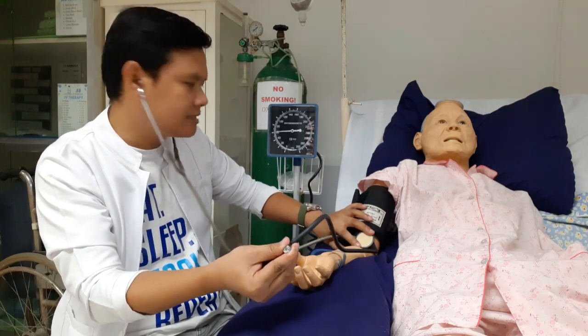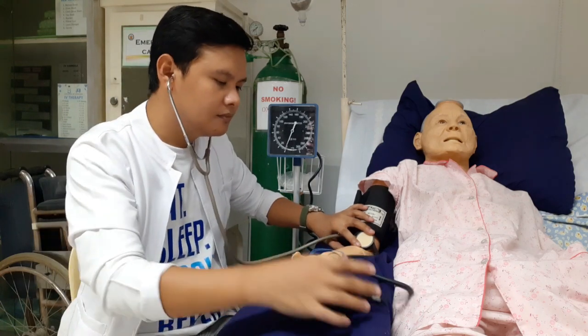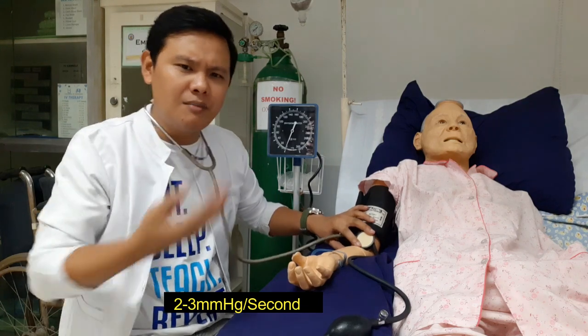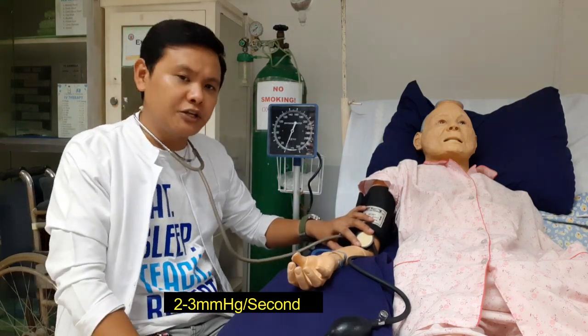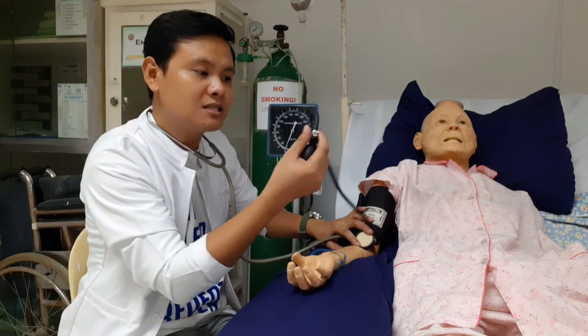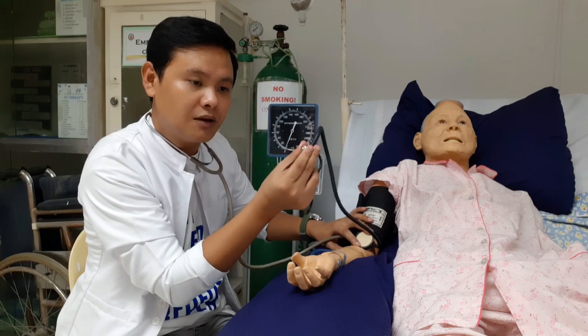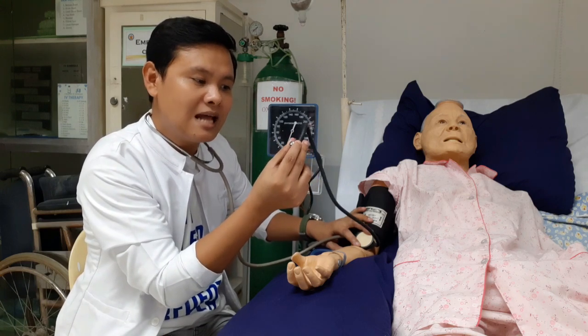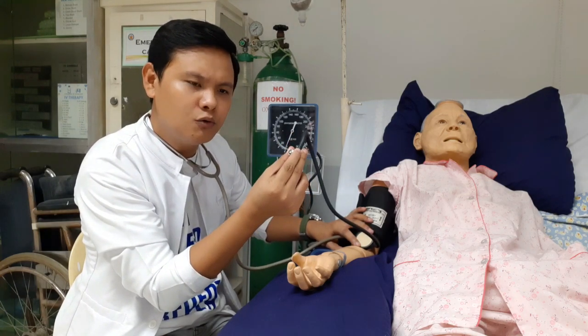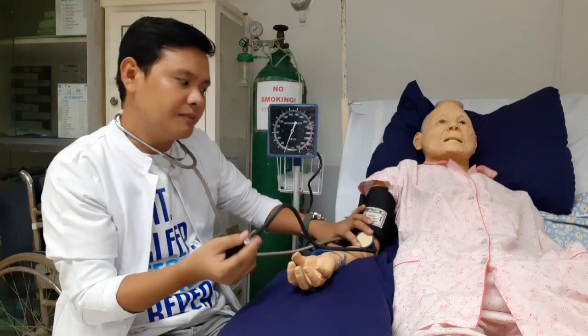Sir, gaano po kabilis? Gaano kabilis yan? About 2 to 3 mm of mercury dapat yung bilis niya, yung pagbaba noong dial. So hindi mo to basta-basta bibitawan na lang. Kaya as much as possible, kontrolin mo yung pagbitaw o yung pag-open ng valve. Maliit lang, dahan-dahan lang. Kaya hanggang sa makuha mo yung 2 to 3 mm of mercury. Okay. Dahan-dahan lang dapat. Huwag masyado mabilis.